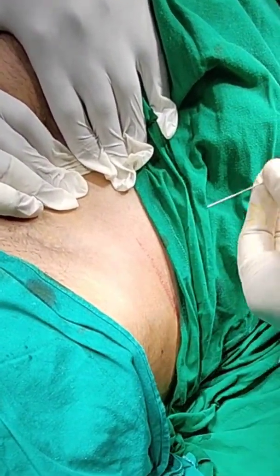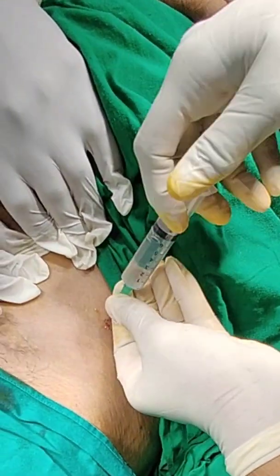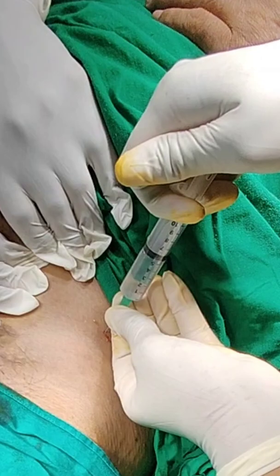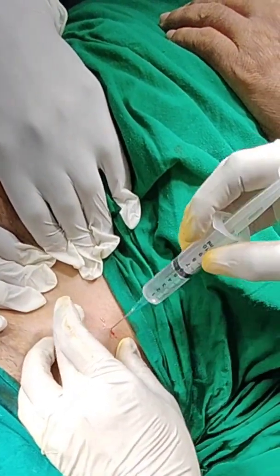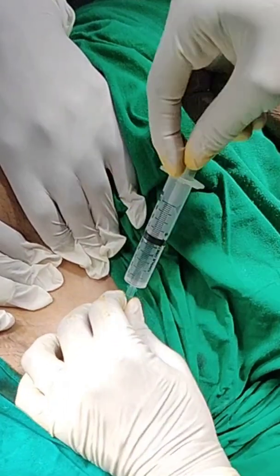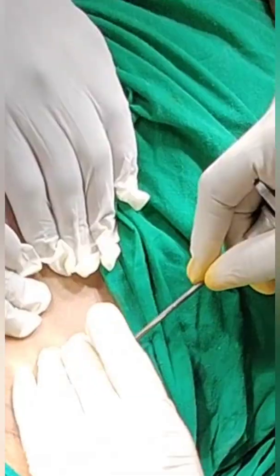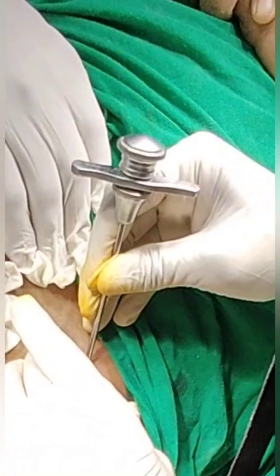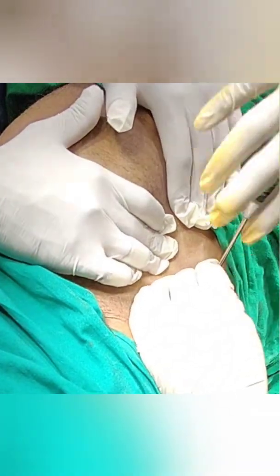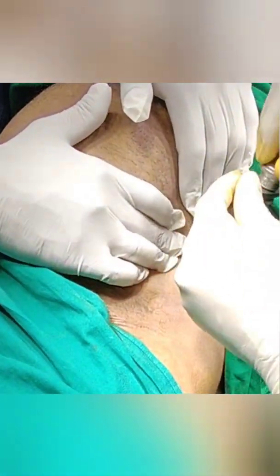Now we are giving local anesthesia at the tip of ASIS. This is the Jamshedhi needle — you just have to put it over the ASIS and rotate it for about half centimeter.